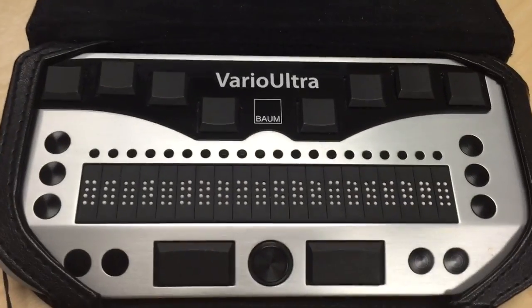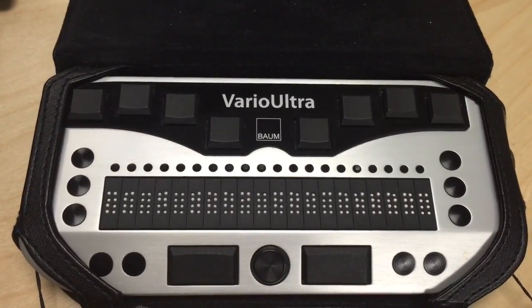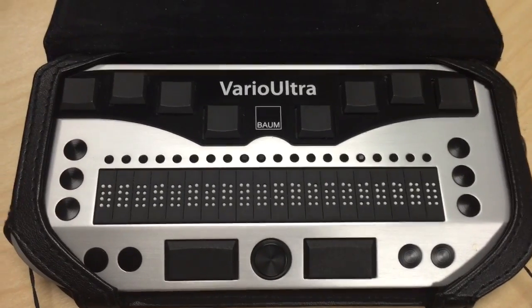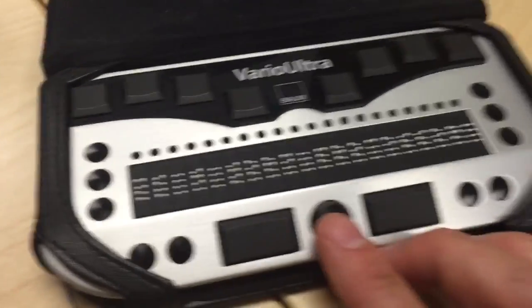I have both models with me today. Vario Ultra is a very smart braille display, and we refer to it as being very smart because it's not just a braille display. In fact, it's a braille note taker as well. When you're in braille note taker mode, you have access to a suite of applications.